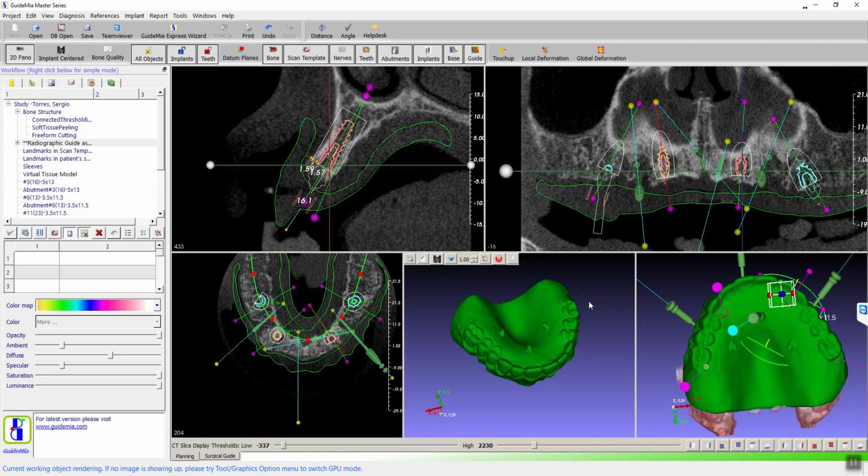We may not want something in the patient's mouth that makes them gag. But we could take this with our extended flanges, print it and send it to them and say, recall your patient, try this. It's better than another CT scan. That was an important discussion, and it was a consistent problem with Nobel Clinician because we couldn't extend the flanges. We had no tool. Okay. Thank you. All right, continue.